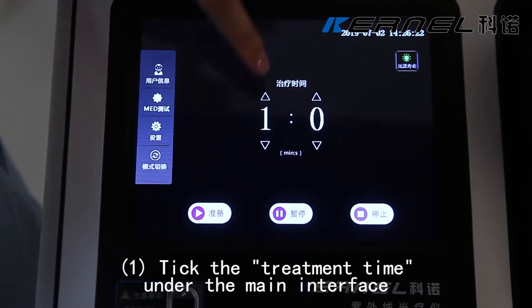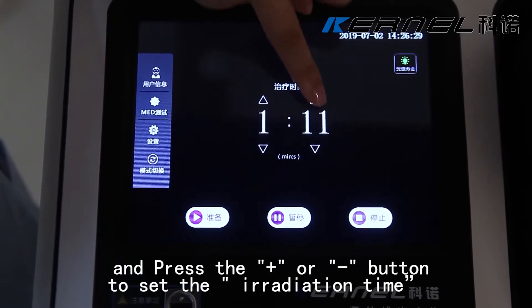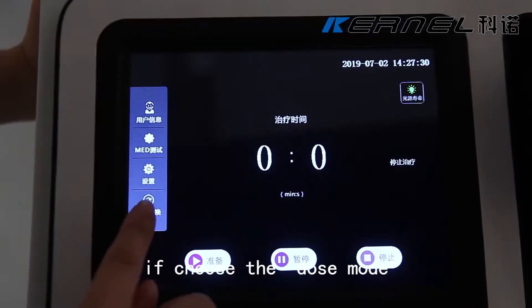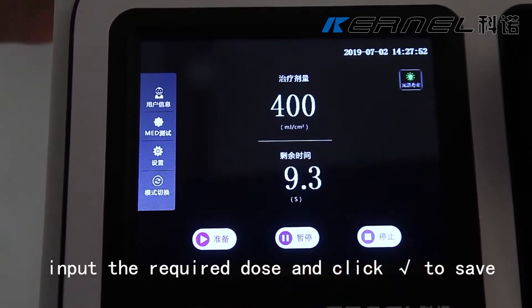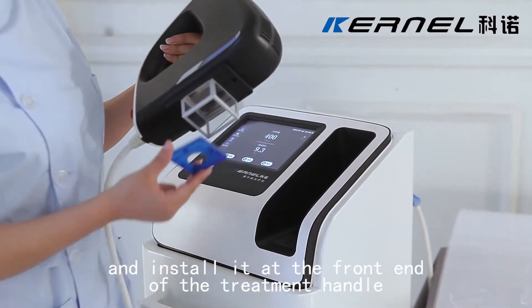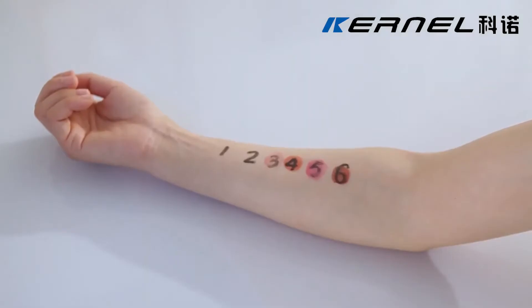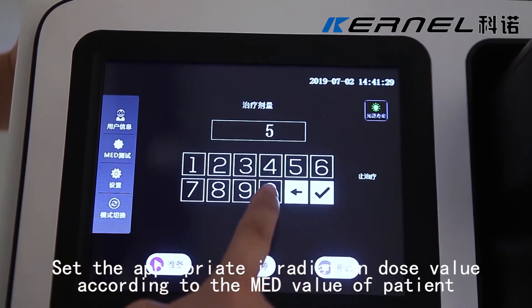Step 4: Treatment. Tick the treatment time under the main interface and press the add or subtract button to set the irradiation time. If choosing the dose mode, input the required dose and click right to save. Choose the shade sheet according to the size of the treatment area and install it at the front end of the treatment handle. Set the appropriate irradiation dose value according to the patient's value.